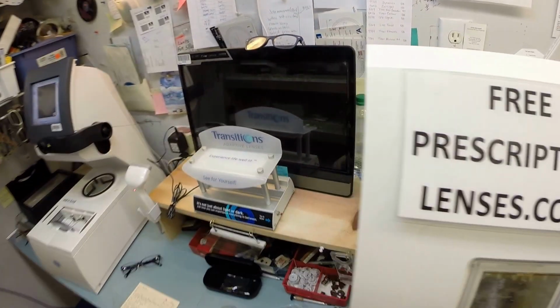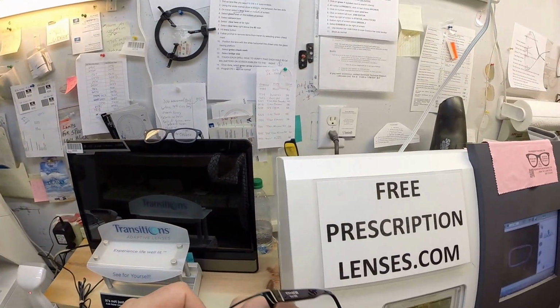And now it's going to drop down onto the bevel wheel, and it's going to get the knife-like bevel, a very dull knife like me, but knife-like bevel nonetheless. But your lens will be so sharp when it's done that you might be able to cut through a piece of wet tissue, providing that you soak the tissue in a bucket of water overnight and then press down really hard. Yeah, it is actually getting the bevel placed on there so it stays inside the bevel of the frame.